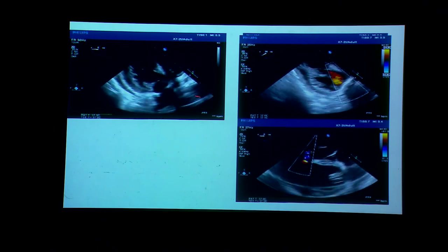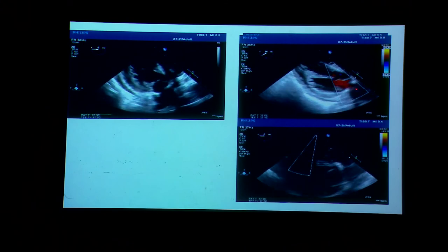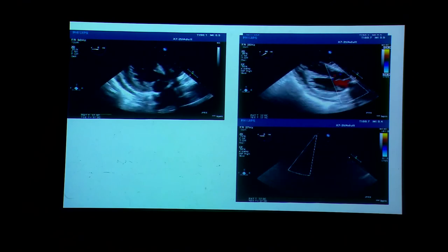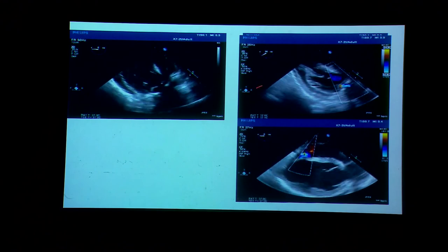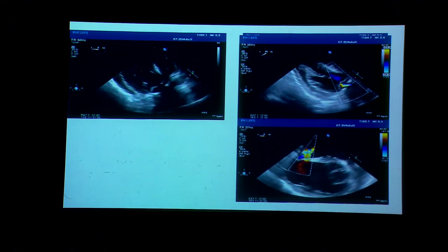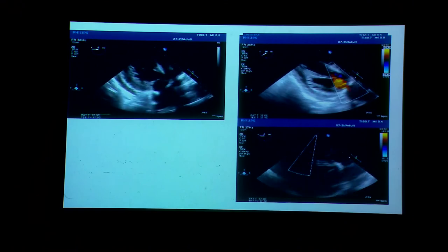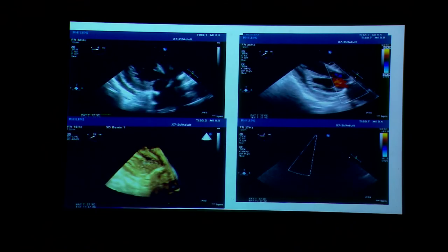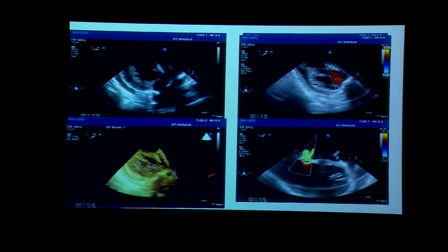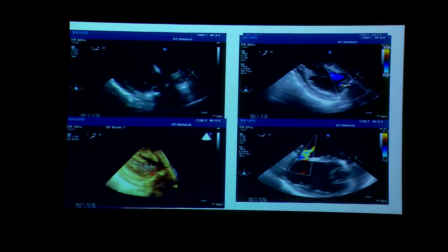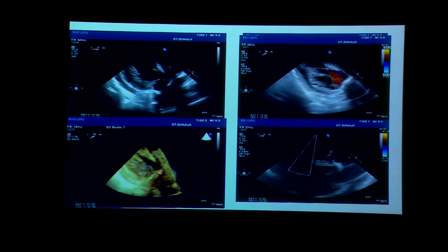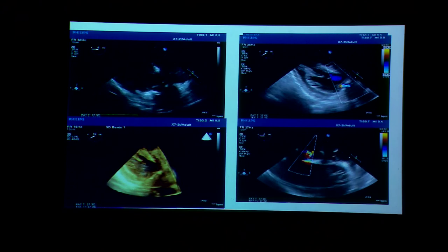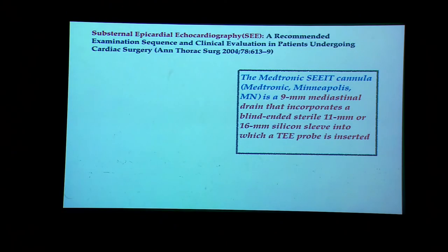In one case from yesterday, epicardial echo showed mild MR, but when we performed TEE for the same patient, we found an eccentric jet reaching right up to the top of the left atrium. So when truly ruling out mitral regurgitation, transesophageal echocardiography is the preferred modality — but if it cannot be done, epicardial echocardiography is a reasonable alternative. With a 3D TEE probe used epicardially, we can see the complete sub-mitral apparatus of the left ventricle including the mitral valve ring after repair.